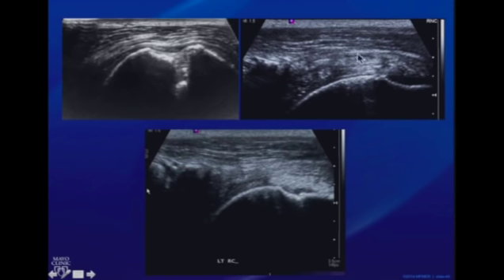This is also a postoperative rotator cuff, very heterogeneous in appearance, and there was suspicion that we might be dealing with some kind of tear. However, we know that the rotator cuff is not watertight once it's been repaired, so we also felt that this might be just a little bit of fluid in there. Now the advantage of evaluating a post-op rotator cuff by ultrasound over MR is that you can do dynamic maneuvers.